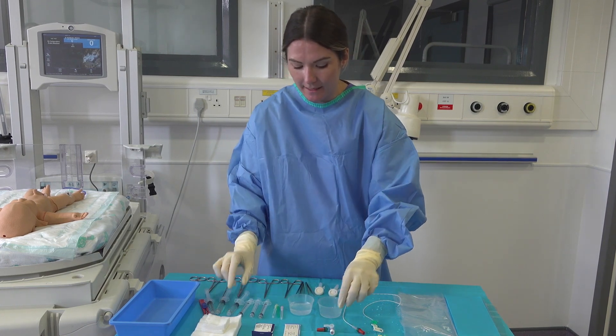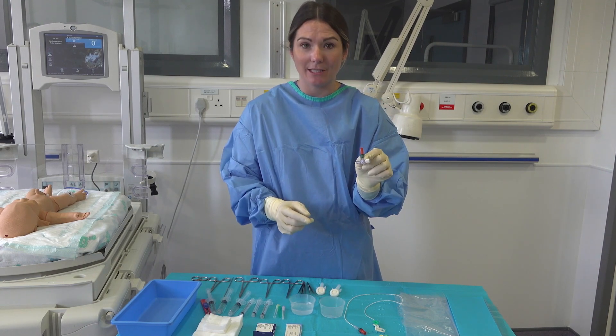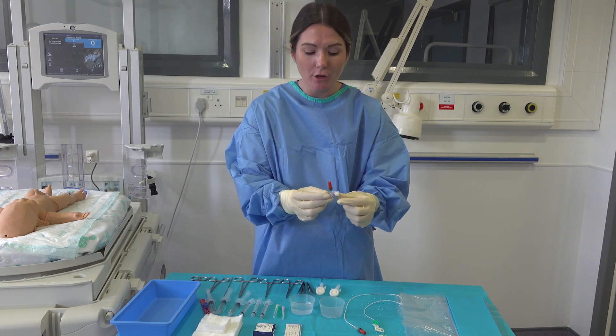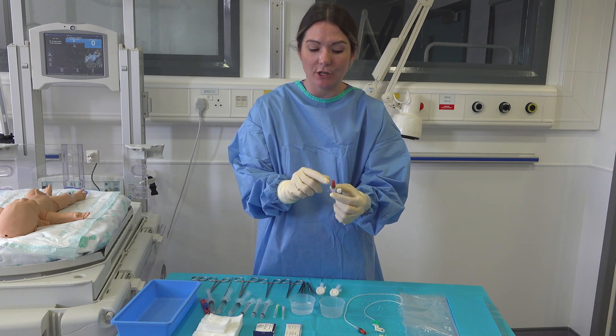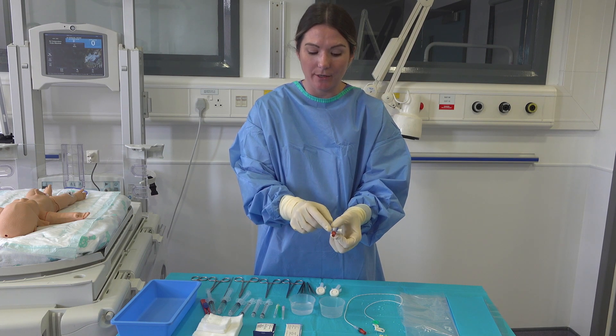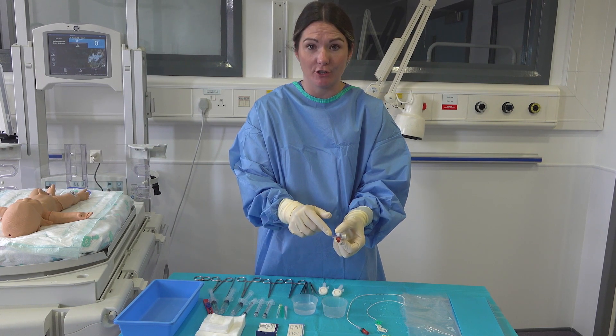Once our line positions are confirmed and we're starting our heparinized solution, we then add on our luer lock and our three-way lock. We make sure that we have a second luer lock on the end that we are going to sample from, as shown here. This has already been prepared and flushed through.